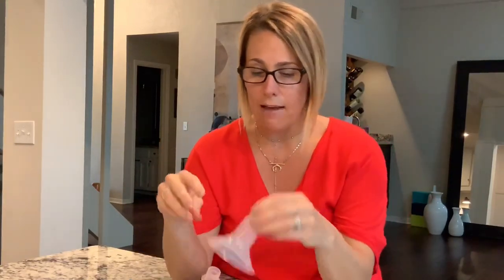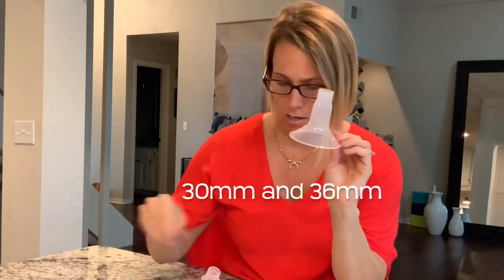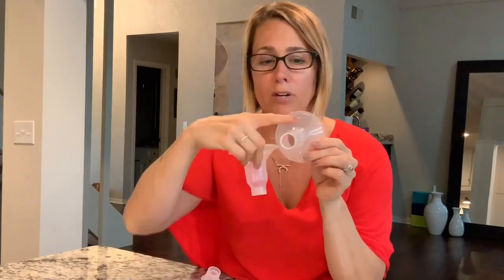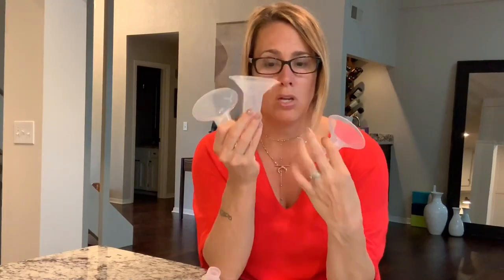Then we have the 30 millimeter and the 36 millimeter. You can see just by looking the big difference in the size of the tunnel where the nipple is expanding. There is a special order glass Medela that's 40 millimeter, but very rarely do we need 36 or 40. Typically we're somewhere in between: 24, 27, 30.